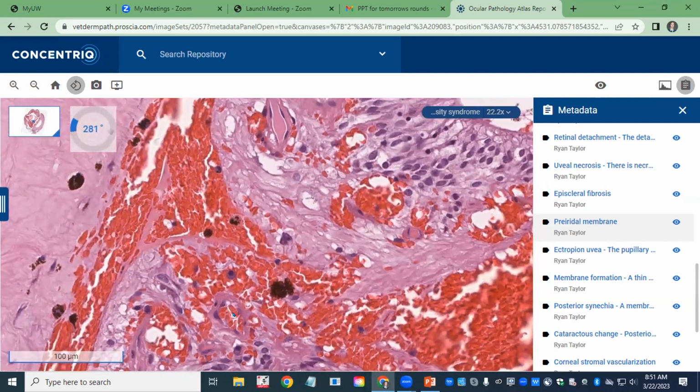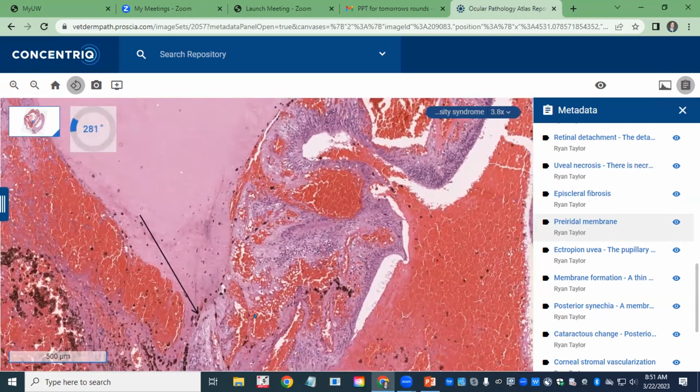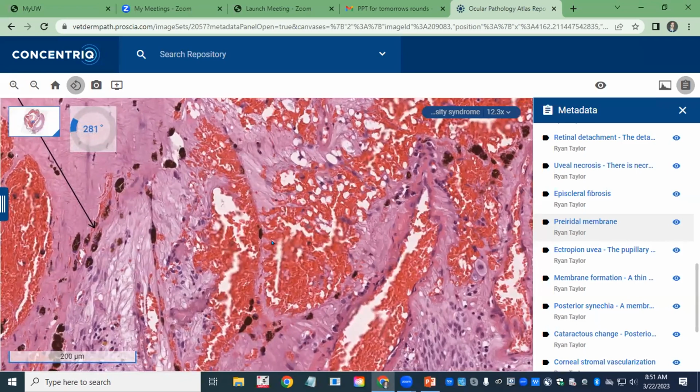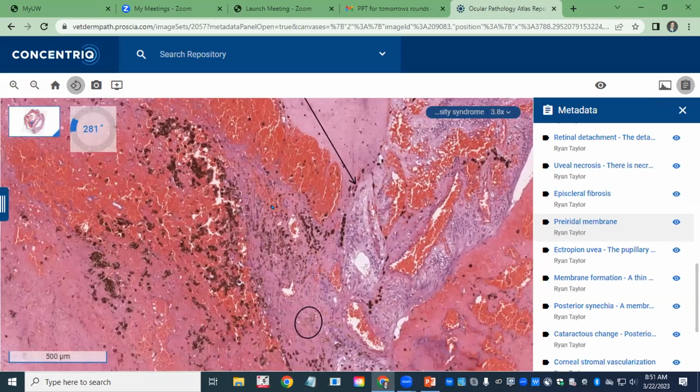But yeah, I would agree that there aren't great areas in the section of the retina nuclei becoming fragmented and completely destroyed. But I think all of what we see is indicative that necrosis had to have been present.